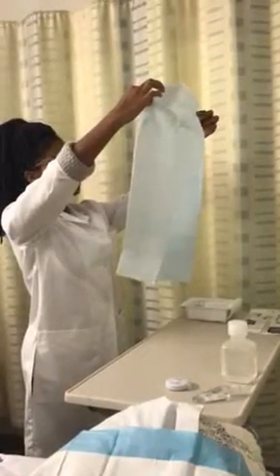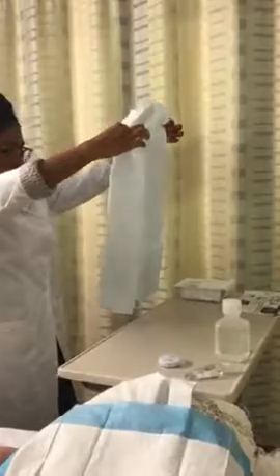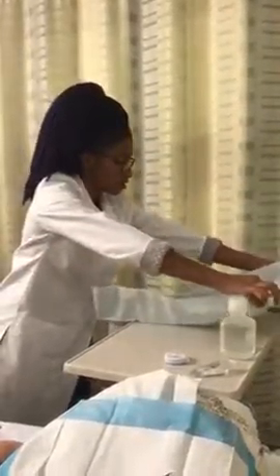Sure to maintain a sterile 1-inch border. And I'm going to lay it.